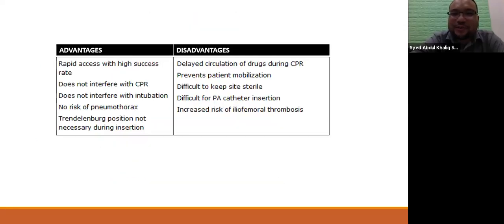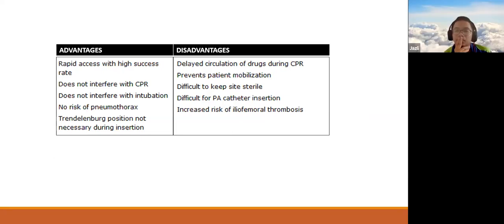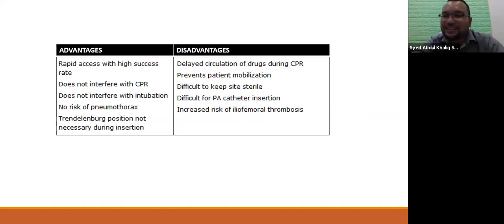Thrombosis, anyway, can cause thrombosis, either femoral thrombosis. What I'm thinking about is actually injury to the bowel. Sometimes in the technique that Zafira showed just now, they use the introducer needle. But here, in our setting, we don't usually use the introducer needle. Why? Because the set itself is expensive and we charge the patient when we use it. So in HTA, in government hospitals also, the set is limited. So we don't usually open the set immediately.